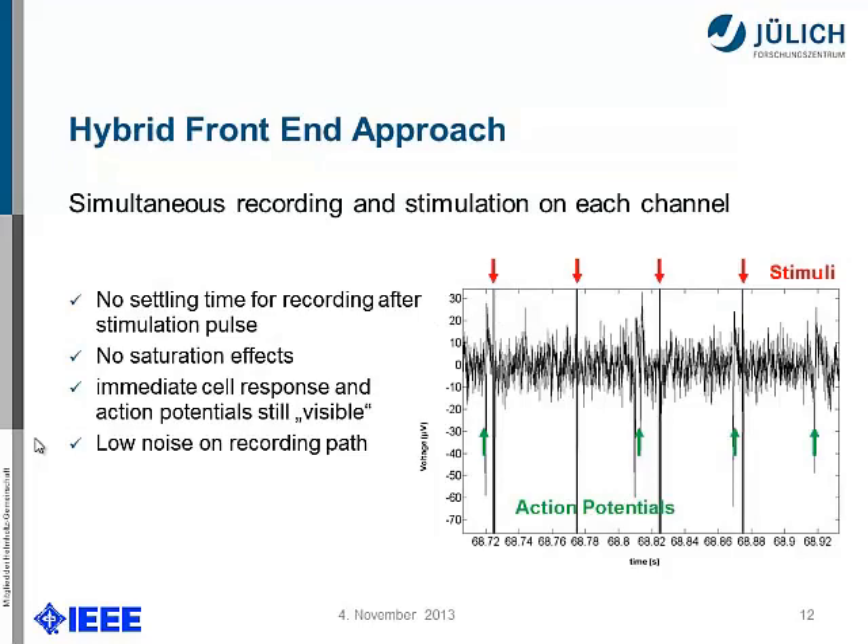This is the first measurement we obtained for simultaneous recording and stimulation on each channel, with one channel shown as representative. You can see four stimulation pulses — the red ones on top — and you can still see action potentials going through. There is no settling time for recording after the stimulation pulse because we don't need a switch. There is no saturation effect, there is an immediate cell response with action potentials still visible, and the signal-to-noise ratio is pretty good.